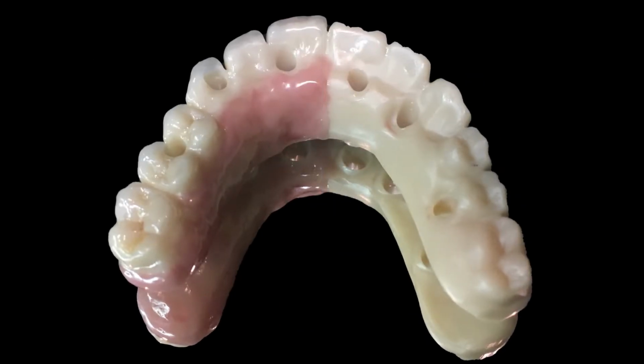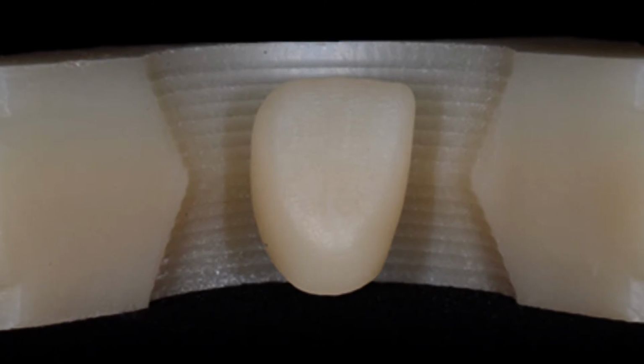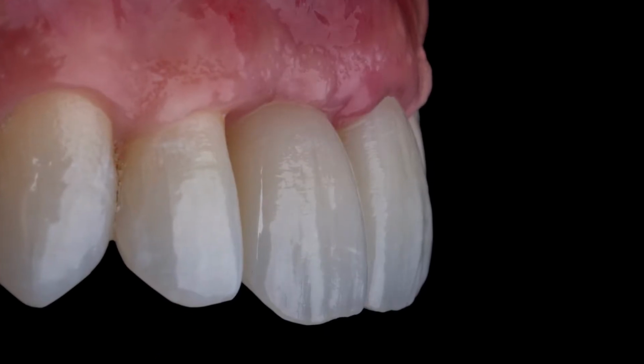Unfortunately today, I still see technicians removing the incisal edge to create aesthetics. In my opinion, this is compromising the restoration, especially on zirconia implant restorations. Jack, do you agree that with all these advancements in zirconia development over the years, there is no longer an aesthetic need to layer these structures, especially in implant application?